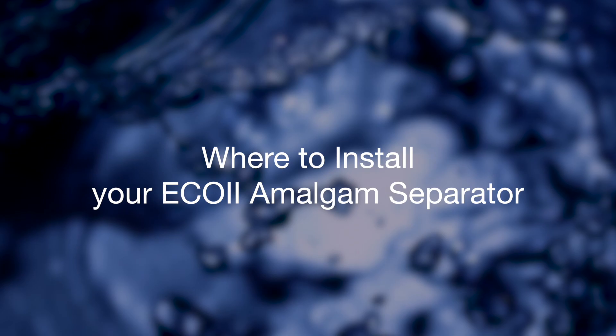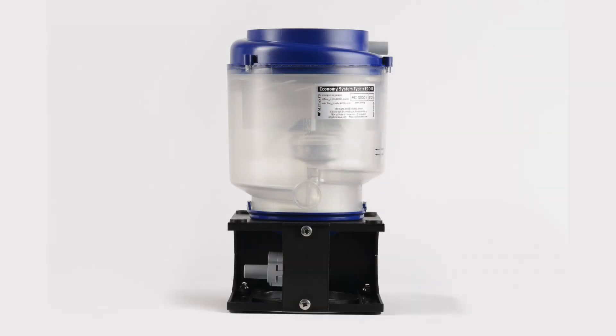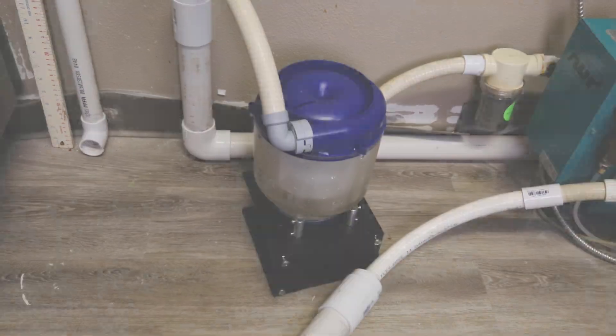Identifying the optimum location for installing the Eco2 amalgam separator on a dental office vacuum piping system. The Eco2 allows a variety of different installation options for both wet and dry vacuum pump systems.